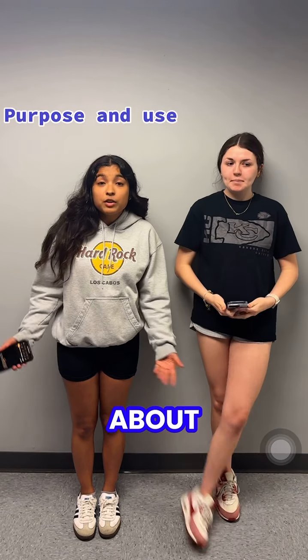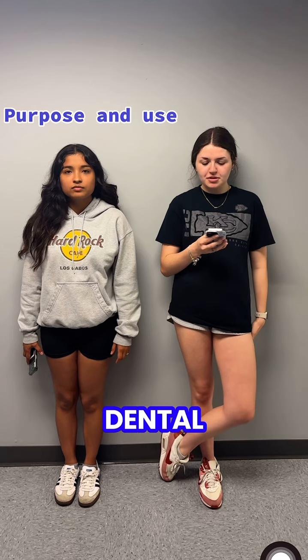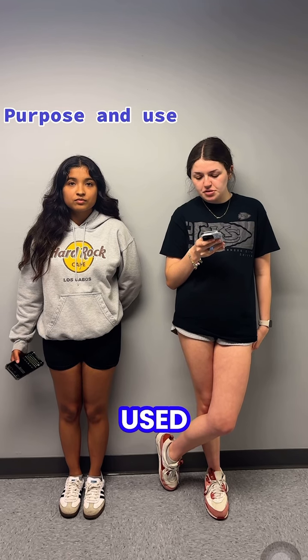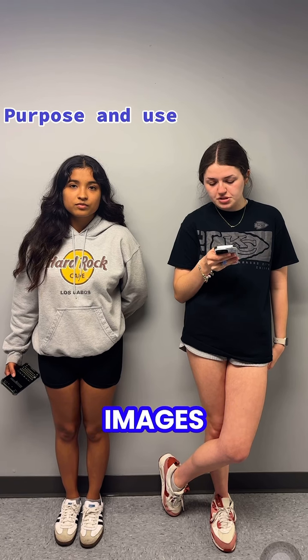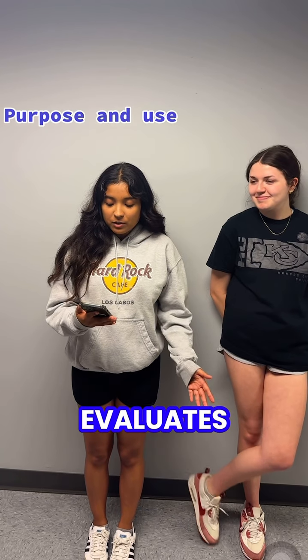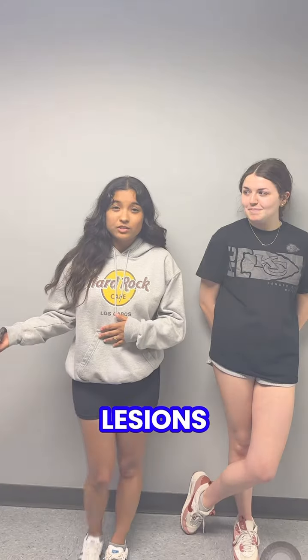So today we're going to be talking about the purpose and use of panoramic imaging. The panoramic image provides the dental radiographer with an overall view of the maxilla and mandible and is often used to supplement bitewing and periapical images. The panoramic image is typically used for the following purposes. So the panoramic evaluates everything from dentition and impacted teeth to detecting diseases and even lesions.